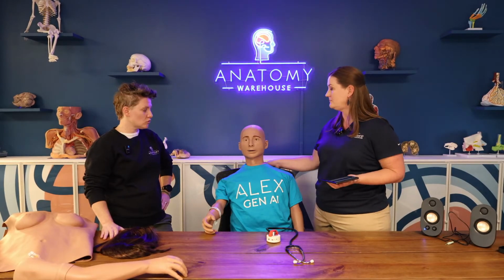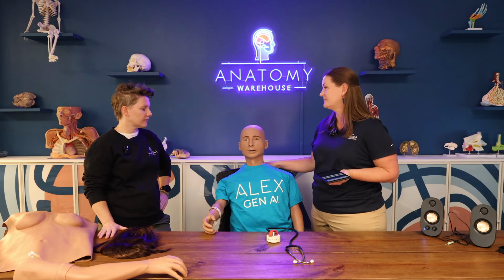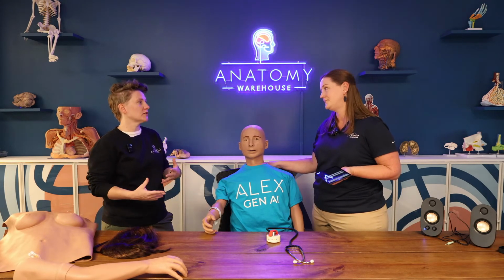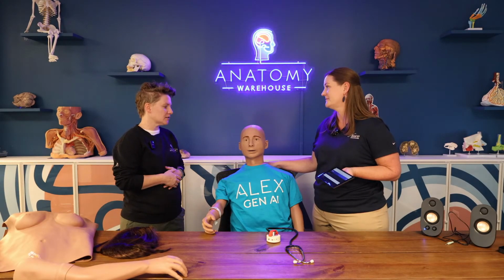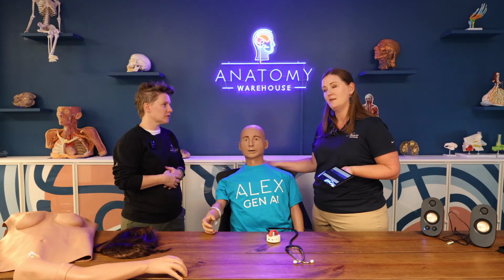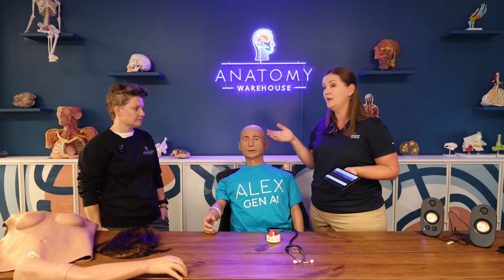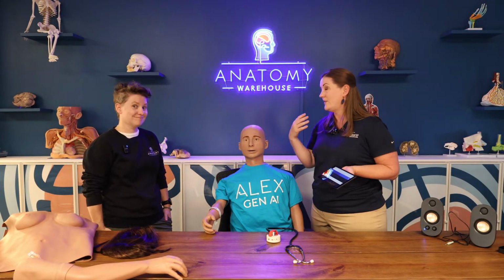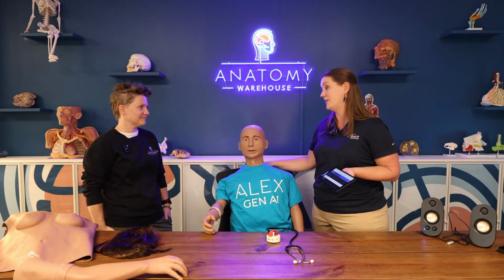I think it's so cool that you have the ability to log the interactions. I know that educators are constantly looking to give students real-time feedback on a personalized level, and I think it's incredible that the mannequin does that so easily for everyone. Absolutely. So Alex can not only see with his iris camera, he can also hear, and then he also subsequently responds. So that AI conversational soft skills part of the mannequin is very, very integral.